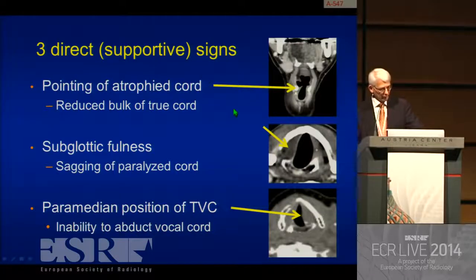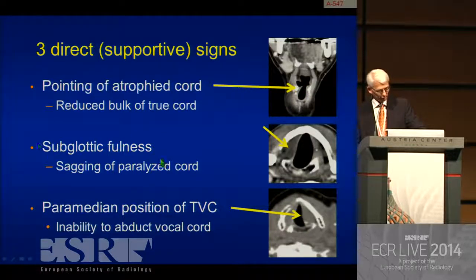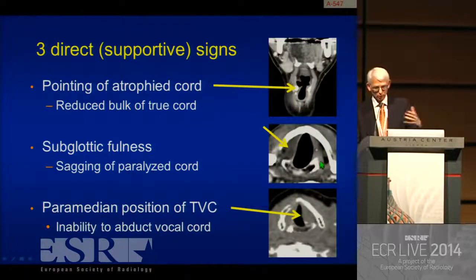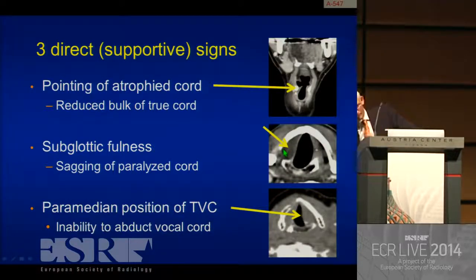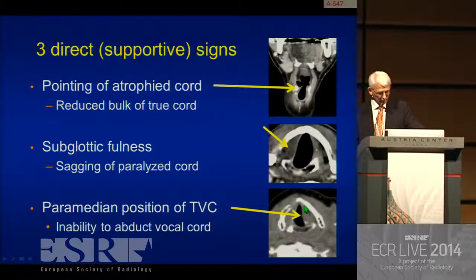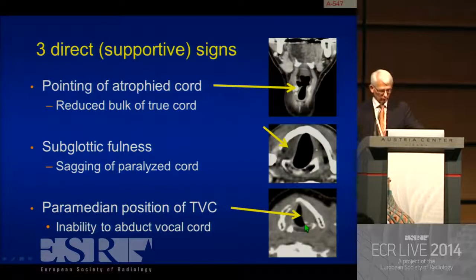The supportive signs: a reduced bulk of the true cord — so-called pointing, which is normally more round. You will also see subglottic fullness — this is the undersurface of the true vocal cord, caudal to the cricoarytenoid joint — with some more tissue on the affected side because of sagging of the paralyzed cord. And you will see the paramedian position of the cord because of the inability to abduct.